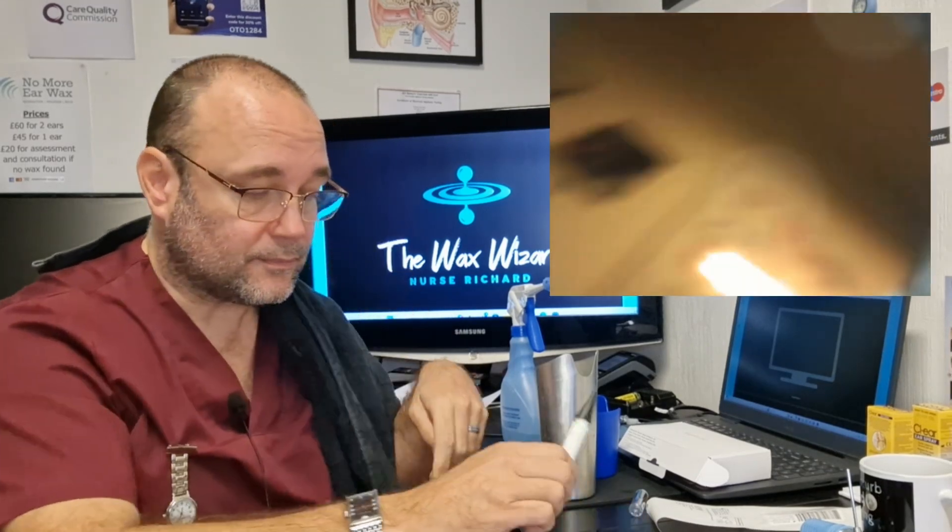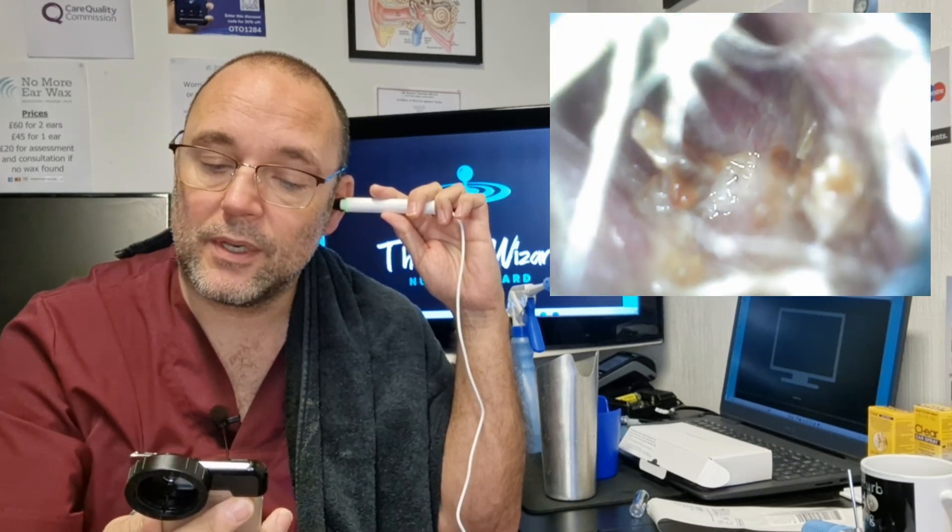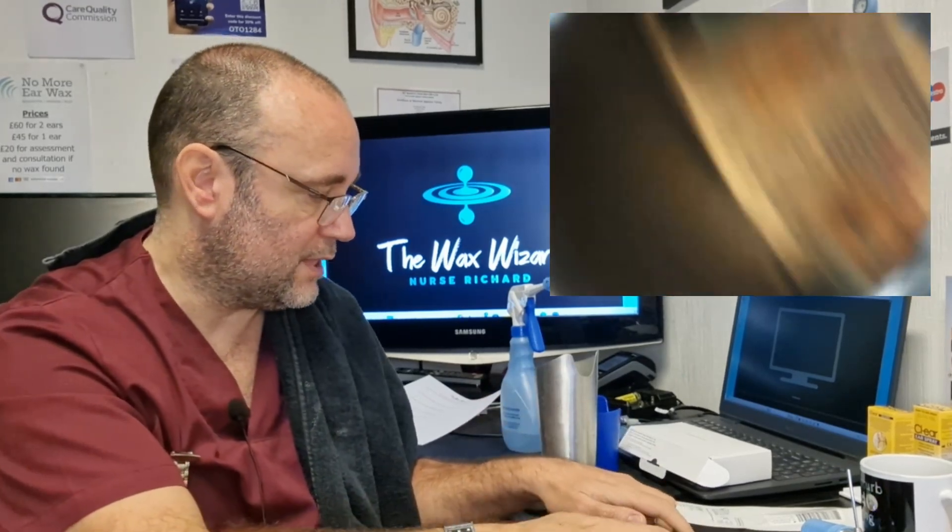Let's give that a right good dry. Cameras and water, not a fan of each other. Let's have a look and see if that's managed to shift that little bit we were after - it doesn't always go first time. You can see my eardrum there, and it's got rid of some - in fact, it's got rid of most of it. It's certainly got rid of that black one. All that remains is just a little bit of skin debris. I'll have one more go, just to see if I can get that.